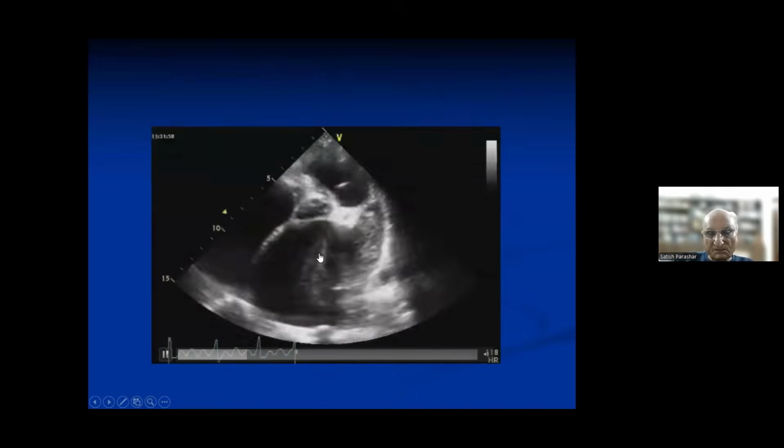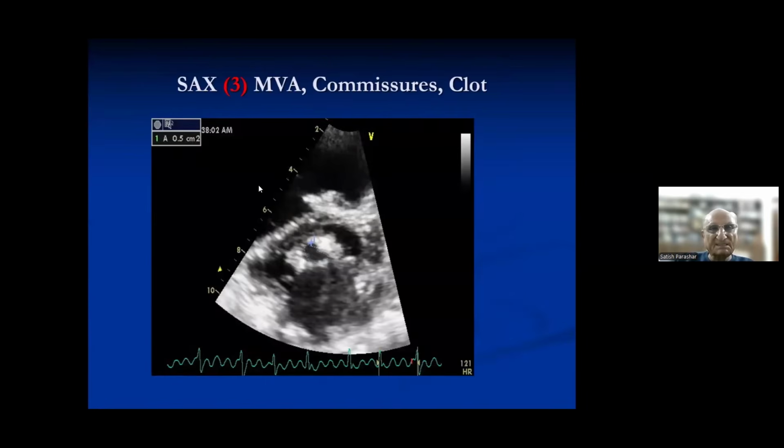In a short axis view, you again see three things. Number one, what is the type of the commissures. They are calcified here. And what is the mitral valve area? So three things you have seen in parasternal long axis view: the separation index, calcification or not, LA clot or not. I'm not going into 2D. In a short axis view, you again see three things: the type of the commissures, fused or not, and the mitral valve area.